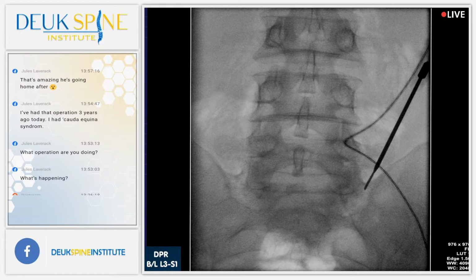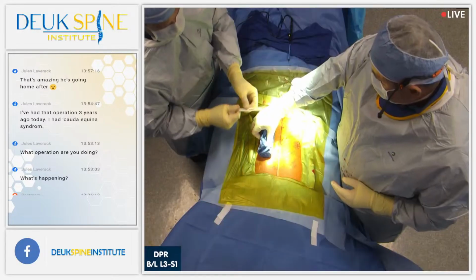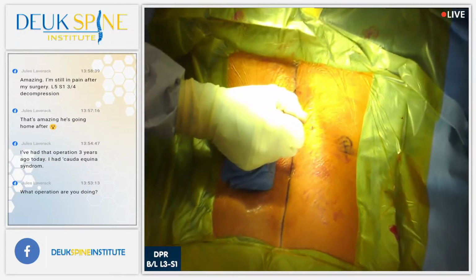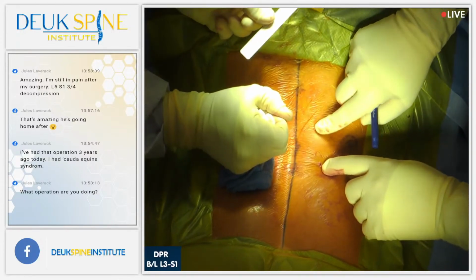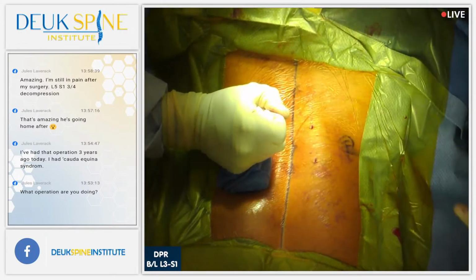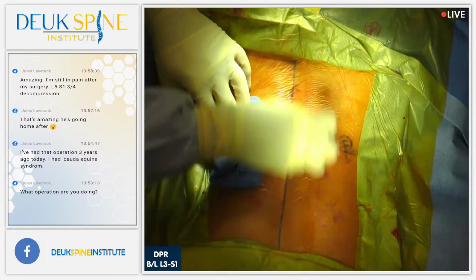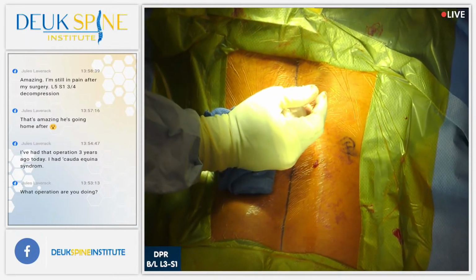And you can see, folks, let's just show them. This side, hold down. Here is one cut, and here is the other. And that's his left side. We did 2 cuts on the right side. And it looks beautiful. He's a very nice, fit young man. He should make a complete recovery from the surgery. Any questions?